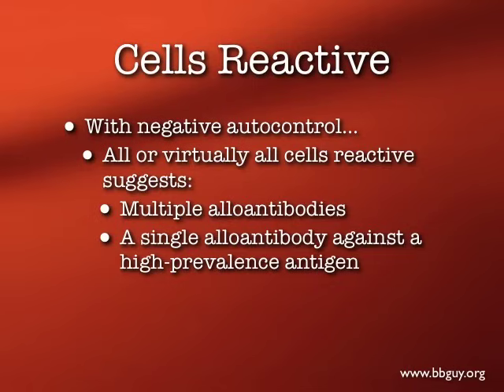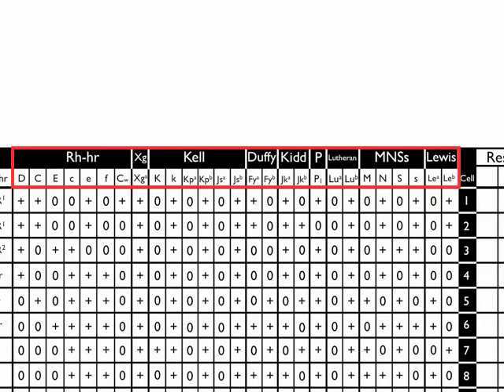Now, in terms of the phases where antibodies tend to react, let me take you through this. Please understand that what I'm about to tell you are general rules, and they're not universally going to be true, but you can usually rely on these for the most part. When we look at the Rh blood group system, antibodies against Rh antigens have a particular characteristic.